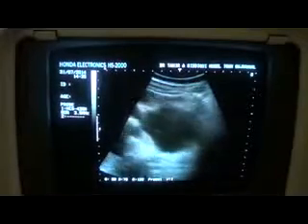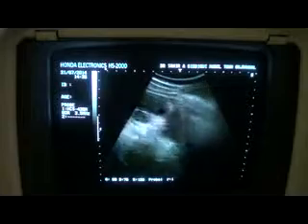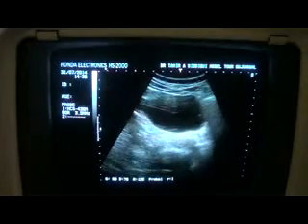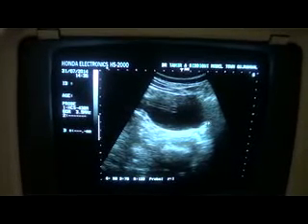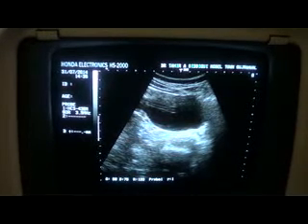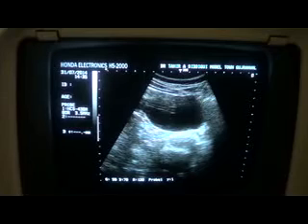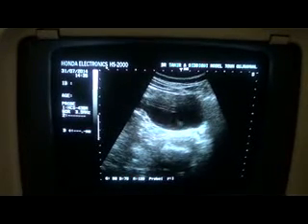I have asked the patient to take a deep breath and hold it so that I may get to the proximal ureter. Now you see here, this is the region of the proximal ureter. This is the area where the proximal ureter will be emanating. Now it is seen that the proximal ureter is showing a stricture, is collapsed, and this is an important point to be noted.